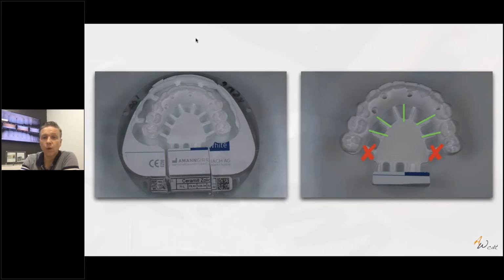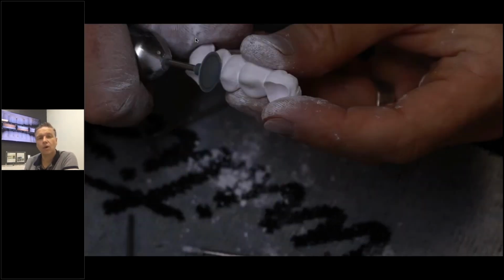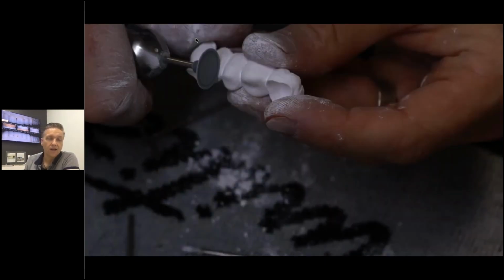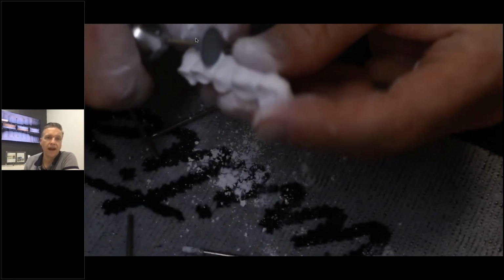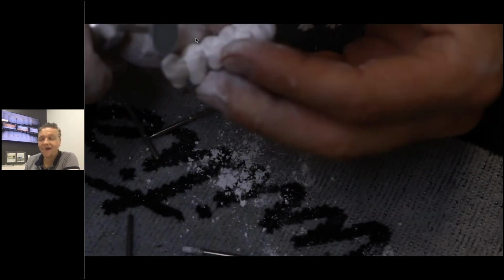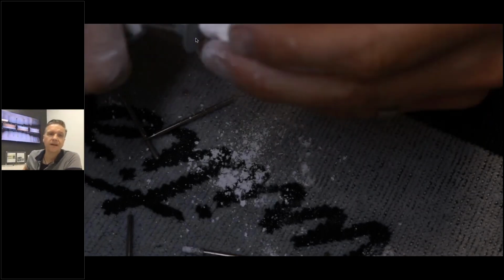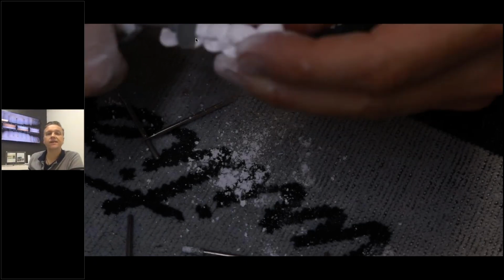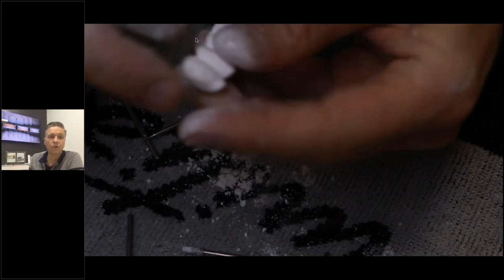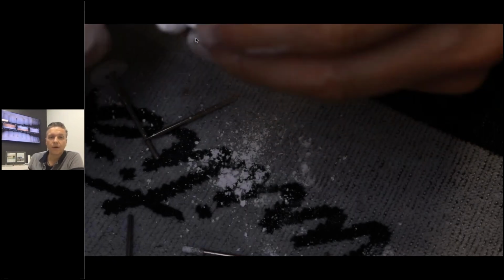And then I just want to go through a little video here about the contouring after milling. I always contour my green state zirconia. There's no way that I would not do that, just to give it the last kick, to make it a little bit more organic looking. Milling machines, especially with our HD modes now in 5-axis milling, can be utilized phenomenally, and they give us incredible results. But to be honest, I'm still missing the organic, natural kick, and I always give that with my bare hands for a couple of minutes. I don't have to go crazy for 2 hours contouring, but if I spend 5 minutes on the 6-unit bridge, I think that's definitely valid.